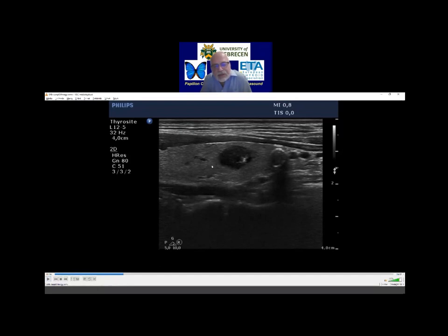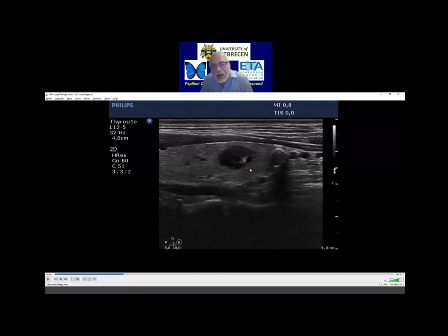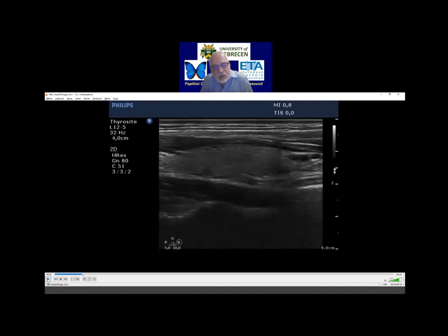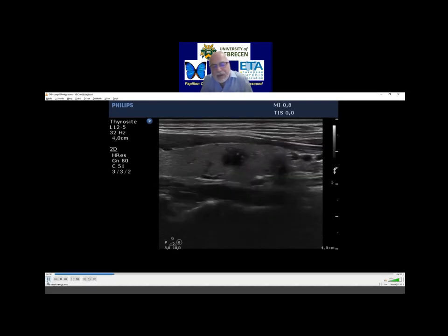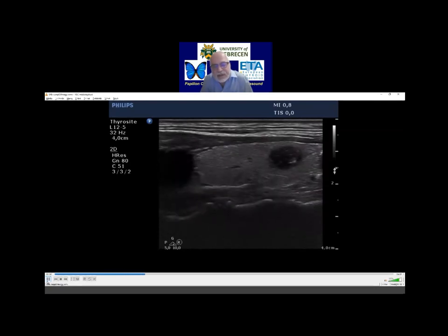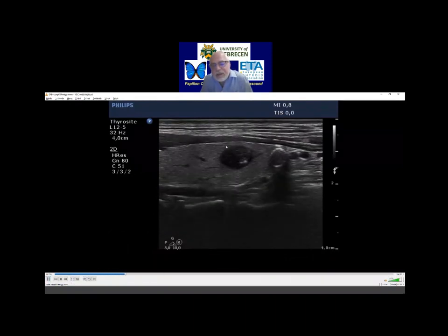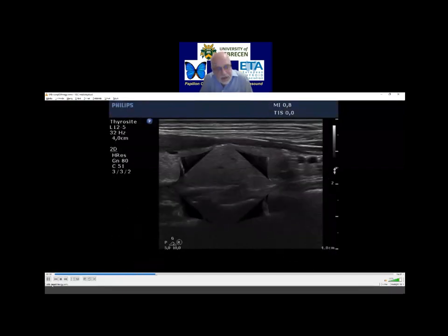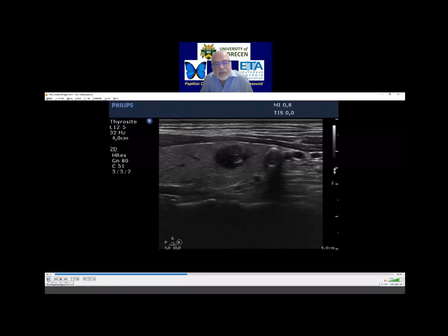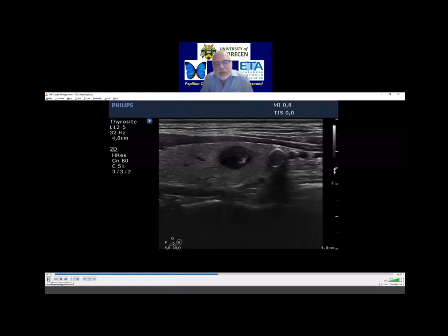Do you have questions regarding this nodule, the echogenic figures? I repeat myself: I don't think that even a highly experienced ultrasonographer would interpret these figures in the same way. I was absolutely not sure that this cannot be a microcalcification. Some colleagues might say this is clearly a microcalcification; others can state this is clearly not. This is not an unequivocal example. But this case is presented for another reason — for the judgment of the echogenicity of the nodule.